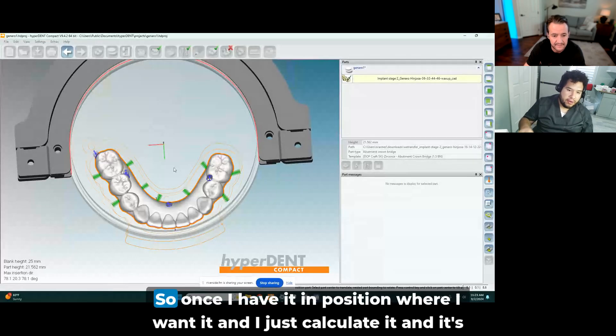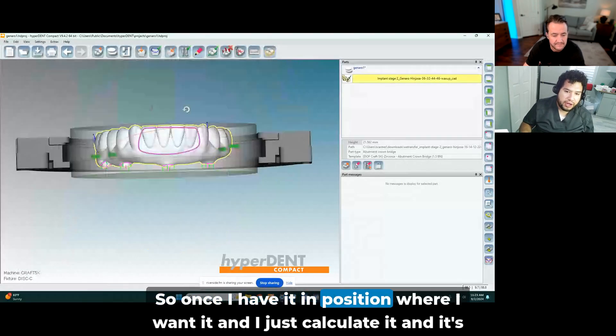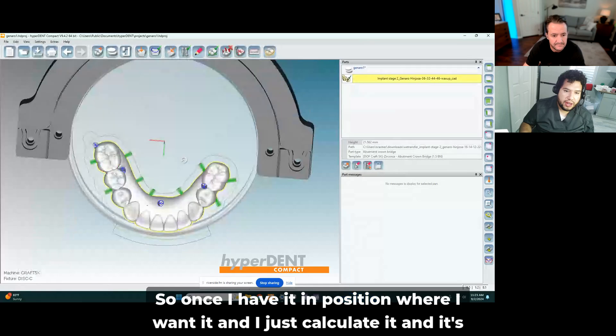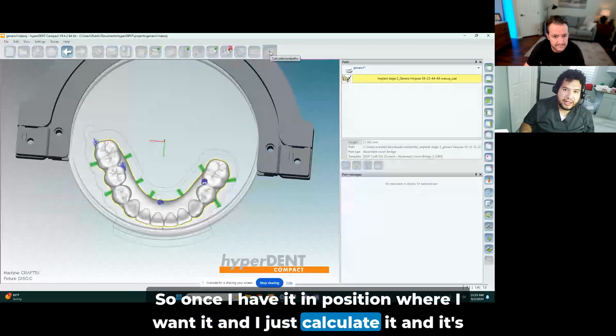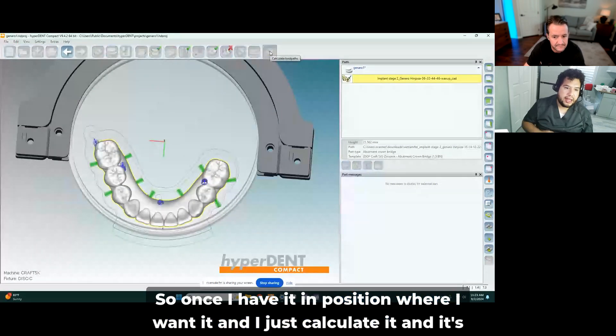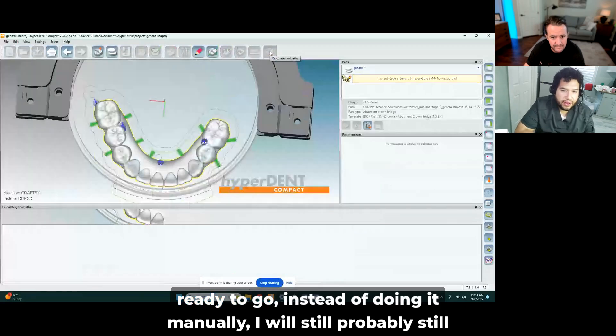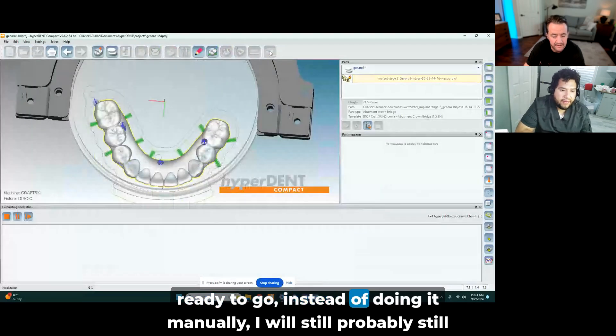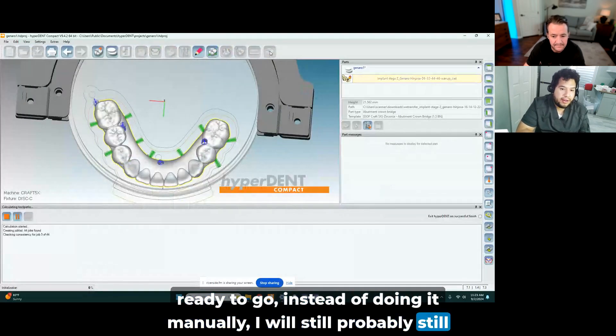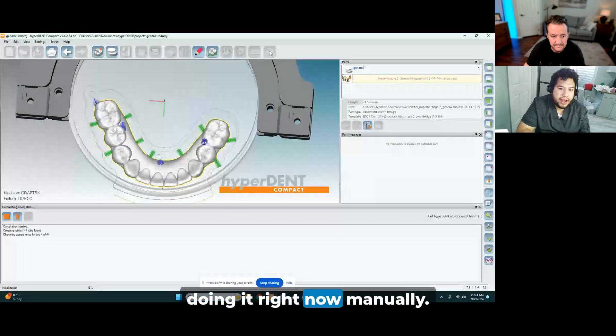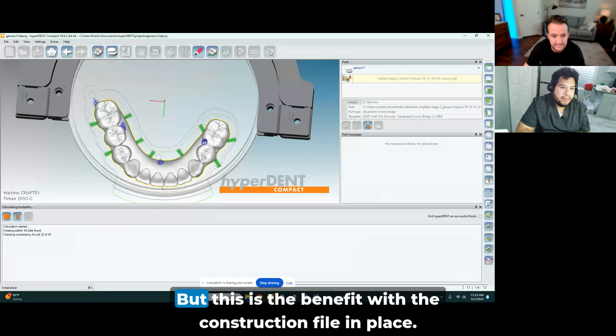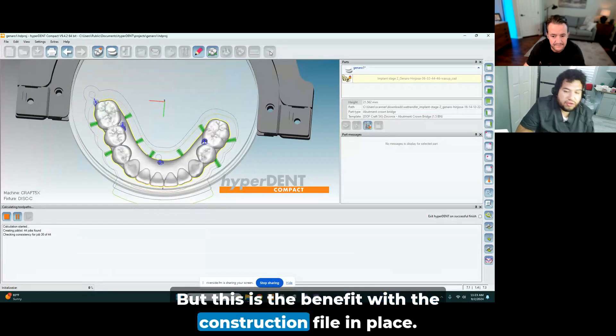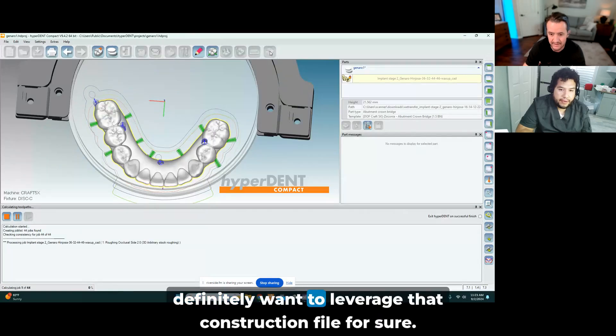So once I have it in position where I want it, I just calculate it and it's ready to go. Instead of doing it manually, I would still probably still be doing it right now manually. But this is the benefit with the construction file in place. Definitely want to leverage that construction file for sure.